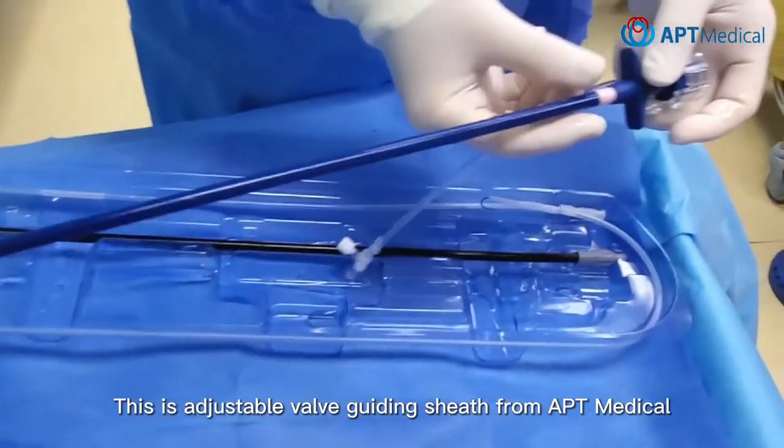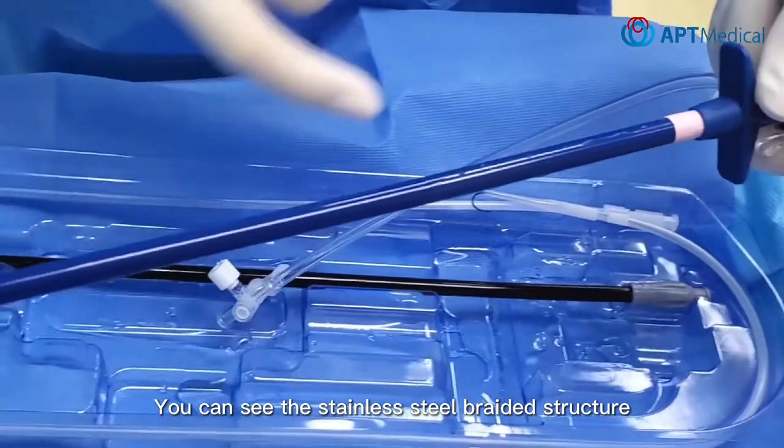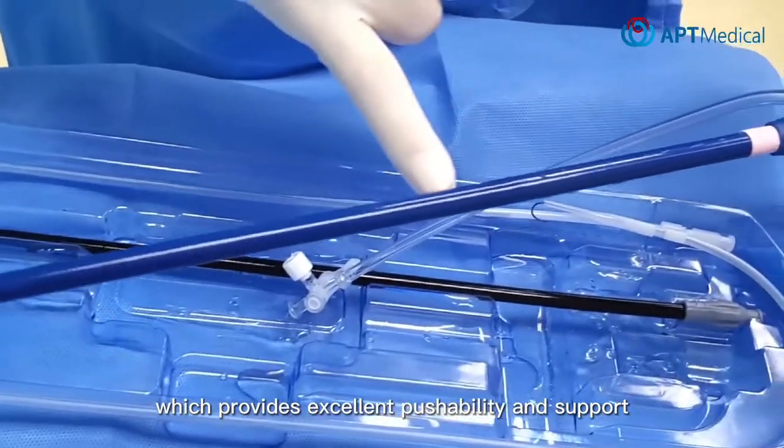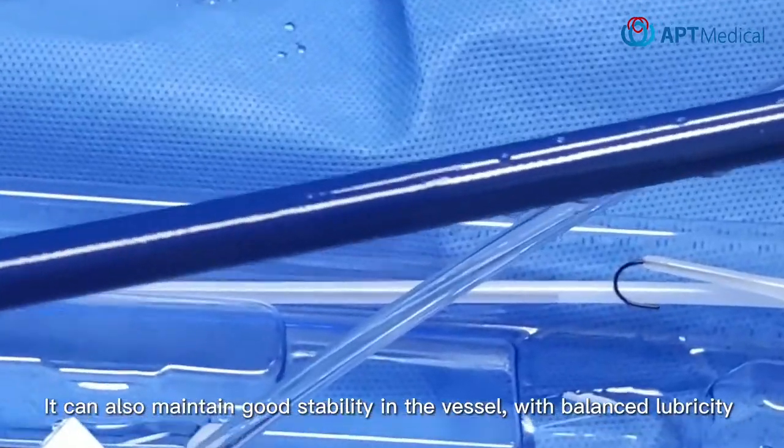This is the adjustable valve guiding sheath from APT Medical. You can see the stainless steel braided structure, which provides excellent pushability and support. It can also maintain good stability in the vessel with balanced lubricity.